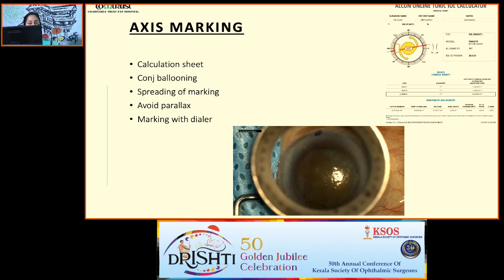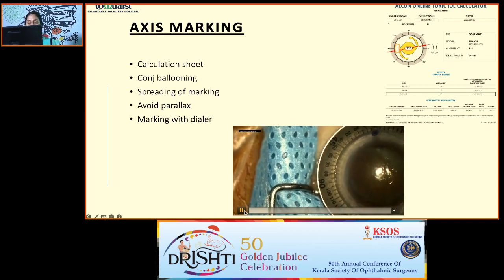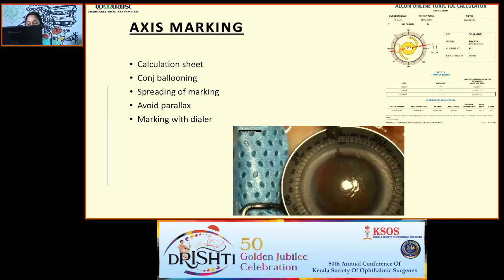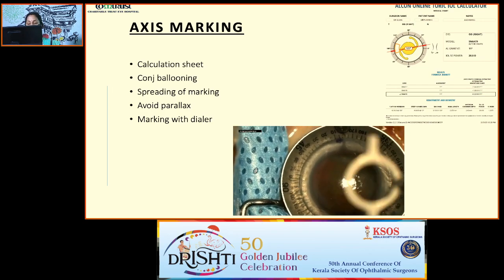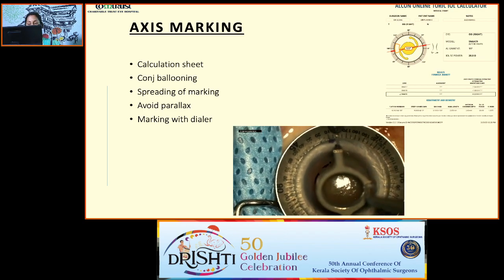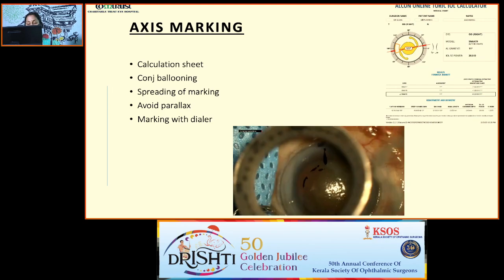If there is any conjunctival ballooning, just swipe the fluid towards the fornix and clear it. And in this video you can see, take the toric dial, keep it over the limbus, align it to the reference axis 0, 180 and take the marker marked with the gentian violet and keep at 11 degree. The marking will be seen clearly, and if the cornea is not dried properly, you can see smudging like this or spreading of marking, which will give poor visualization during your phaco.